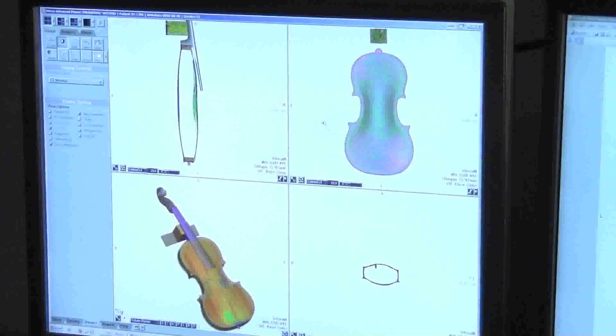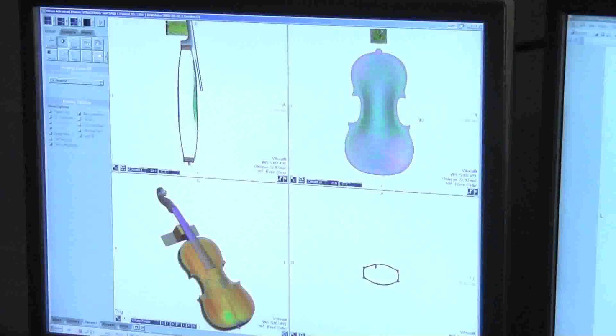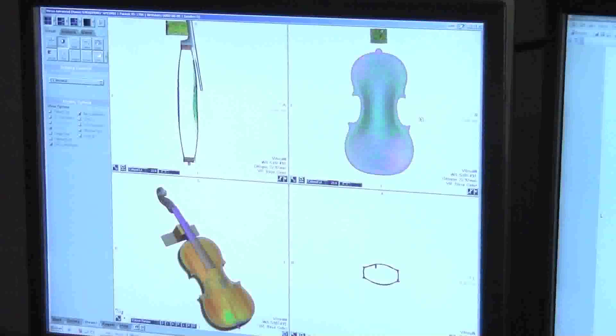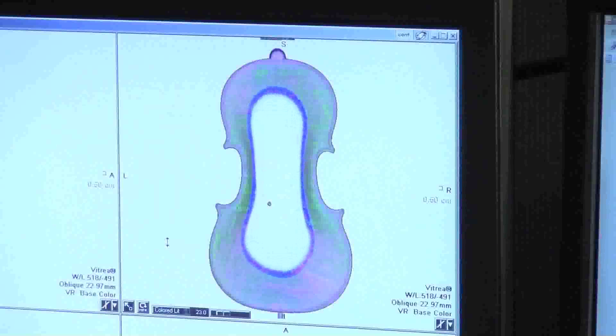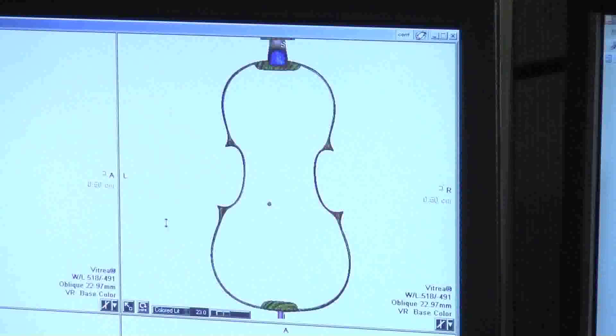This is an example of one of the violins. This is the 1709 Stradivarius. And what I've set up here is a rendering algorithm that shows us various densities in the woods. So the greens and purples are the most dense. This is the back plate of the violin.